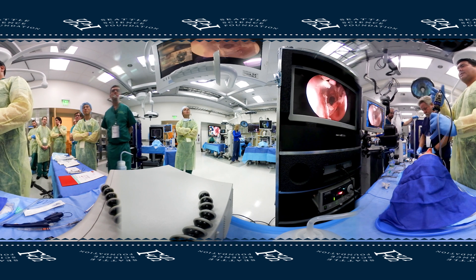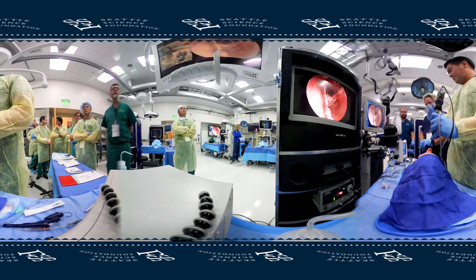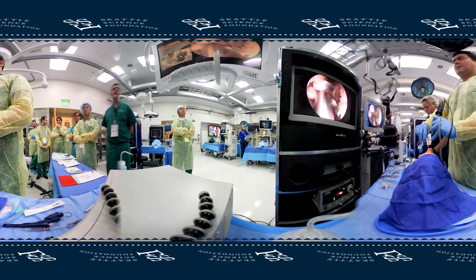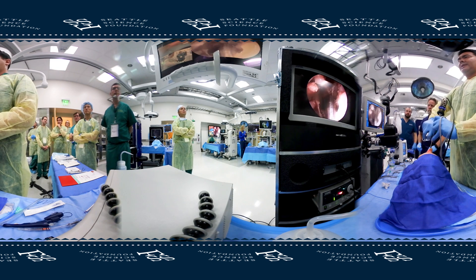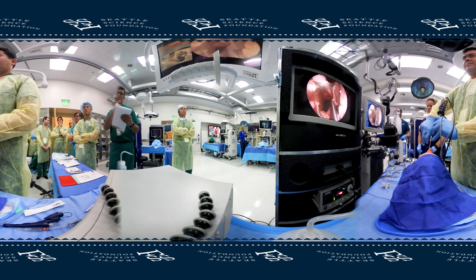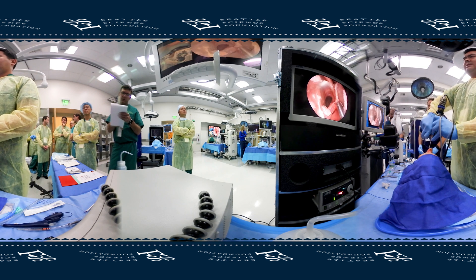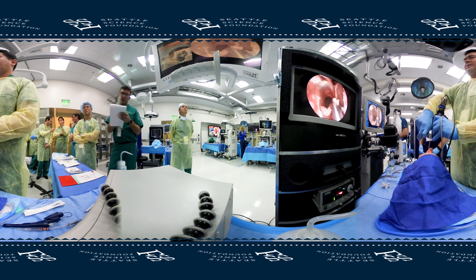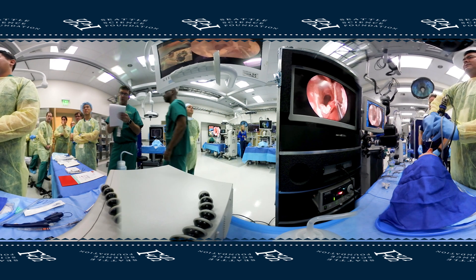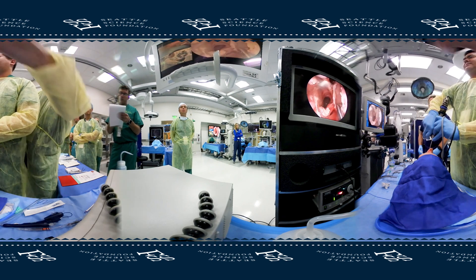There are a couple of ways you can do this antrostomy. You can either come down from above and just take it down towards the nasal floor, or you can basically drill out down below and then come up. These down-biting punches are really, really good for this purpose. Knowing where Hasner's valve is, you can also carry your resection anteriorly down below it — all that is fair game.